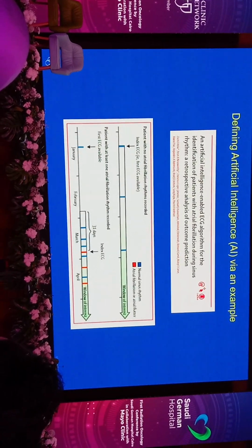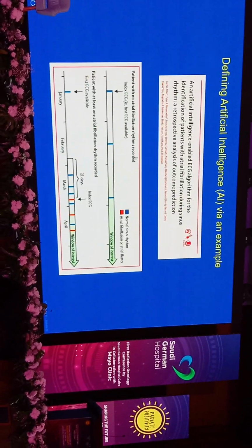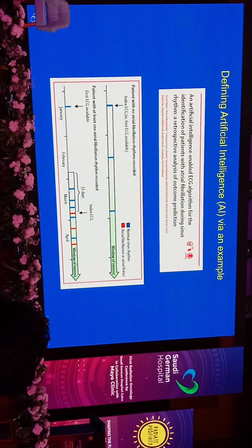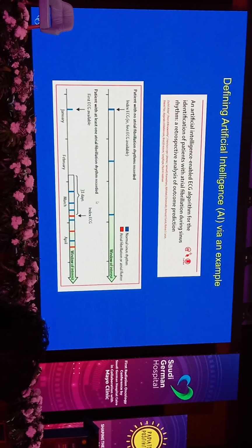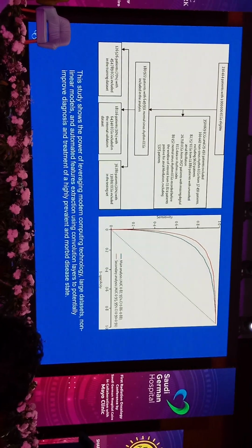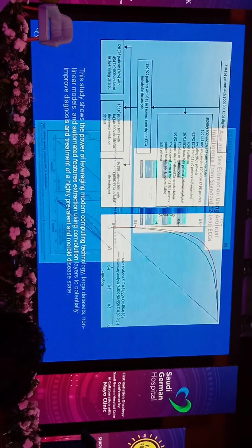And so this example is from the Mayo Clinic cardiology group, where they looked at millions of ECGs, and they were able to look back at patients that eventually had an ECG that had AFib or A-flutter. They were able to pick up that AFib or A-flutter likelihood based on a normal ECG preceding it, which a human was not able to do. And if they had multiple ECGs before the event to analyze, you can see that they had an AUC of 0.9 for being able to predict the development of AFib on subsequent ECGs.